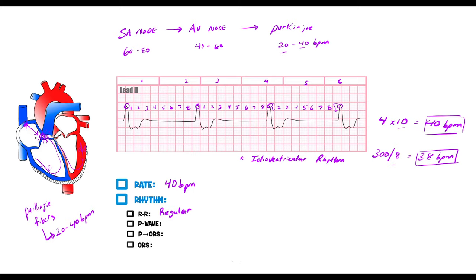Looking for P waves — this is lead two, so we should see an upright P wave if it's sinus. Look for the P wave before the QRS complex... there's no P wave before any QRS complex. No P wave means the SA node is not firing. For a P wave to appear, the SA node, an ectopic area, or even the AV node would need to fire.